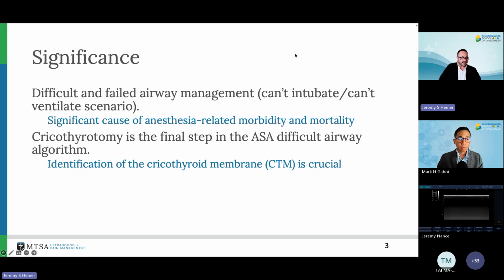You know, it's interesting. If you look at the 2025 Difficult Airway Society difficult airway algorithm, they updated that, and there's a major change. So they simplified their algorithm into really 4 steps: a plan A, plan B, plan C, and plan D. Plan A is your original airway plan, whether that's using VL or direct laryngoscopy, and then if you're having trouble, you mask ventilate. If that plan A fails, it says plan B, go to a supraglottic airway. Plan C is if you have time, you can try ventilating one more time or possibly doing a VL one more time. But then plan D is cricothyrotomy.